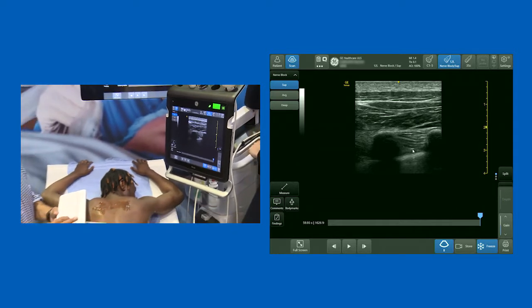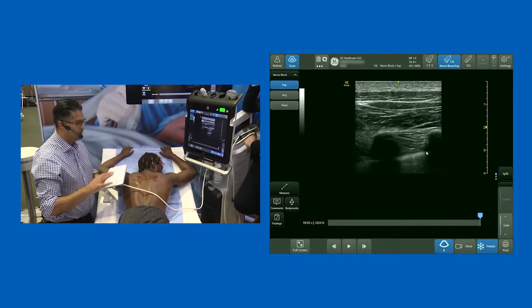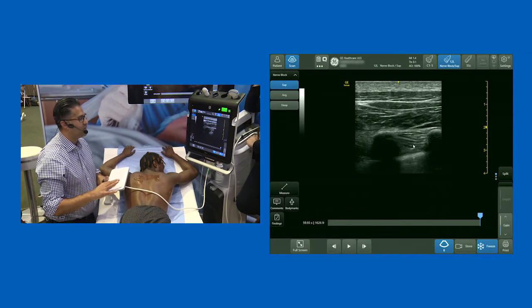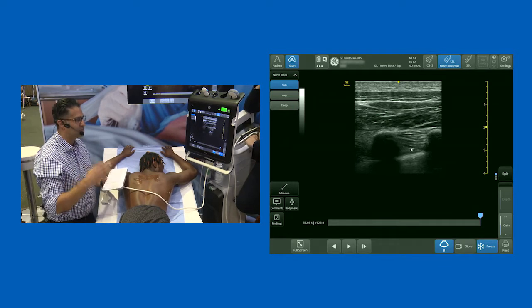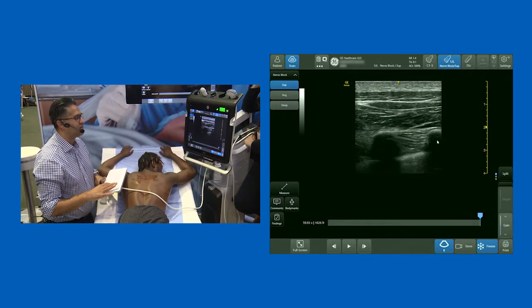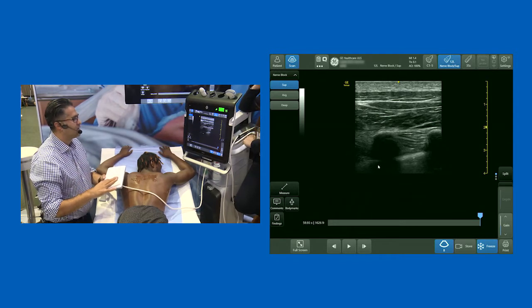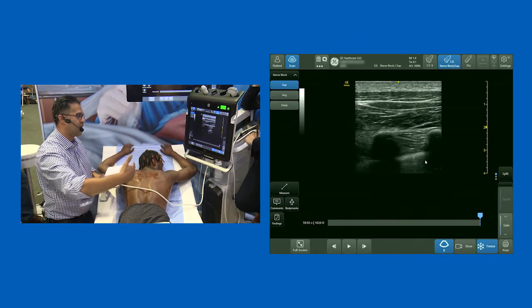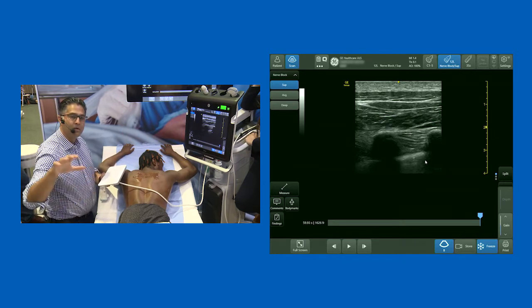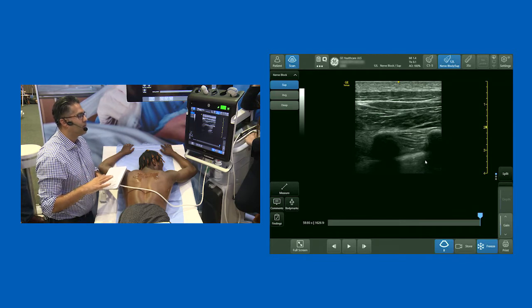Going from the rib below to the transverse process above, you're starting to get the impression of the superior costo-transverse ligament. When I first started teaching paravertebral blocks — and I was taught by John McDonnell — what we said to everyone was: you have to be deep to the superior costo-transverse ligament in order to have a successful paravertebral block. It's quite a satisfying feeling when you go through that, you feel a pop, you know you're there. You inject local anesthetic and you see the pleura drop down at multiple levels.